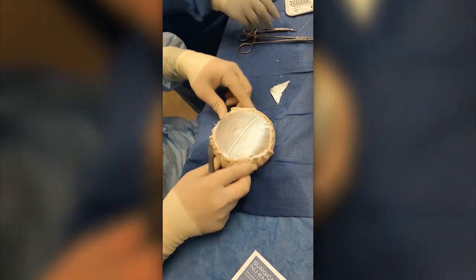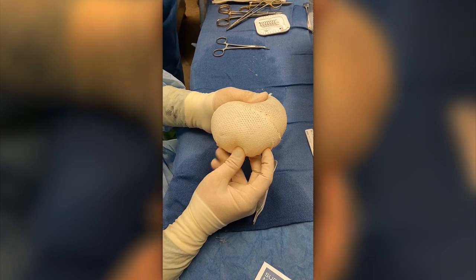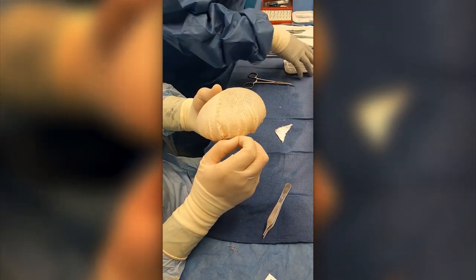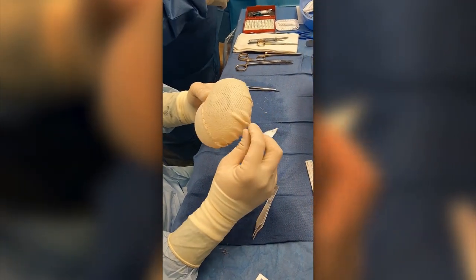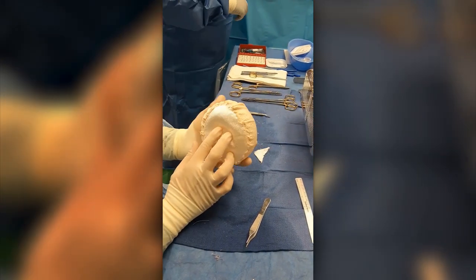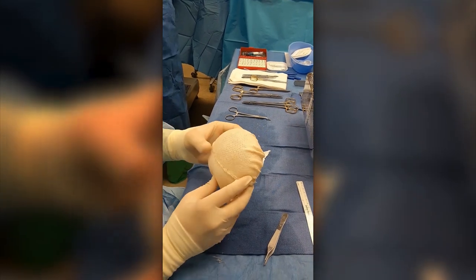This is what we've got now — the front of this device. This seam we put on initially is the two pieces put together along a straight edge. You can see the mesh has expanded nicely around the device and these ridges really don't come into play — they're all the way out on the outside and will be mostly on the chest wall. I actually use these as little anchors to take bites of to make this stick to the chest wall in situ, so I'll place sutures circumferentially if possible, or around the entire lower pole as much as I can reach in a nipple-sparing case. This will hold it in place, and even if this melts away over the next couple of weeks, it would probably not have any impact on this incorporating in the right spot.